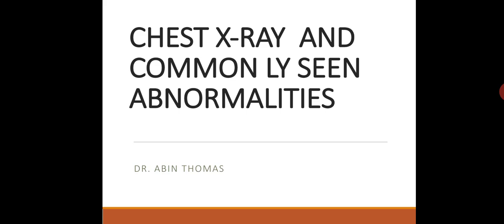The chest X-ray and commonly seen abnormalities. The previous session was on normal chest X-ray, and during that session, I had tried to convey the importance of knowing how a normal chest X-ray looks.